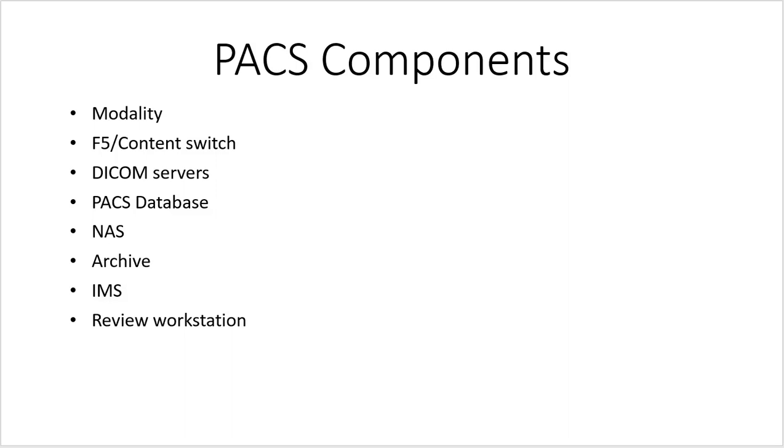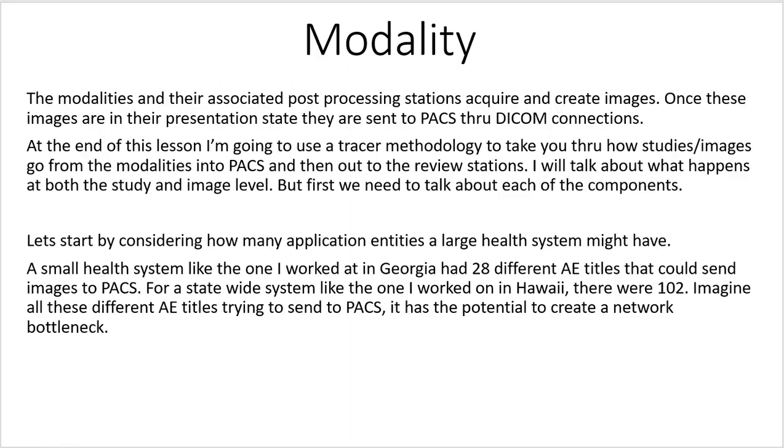Okay, today let's talk about the PACS components. The components of a PACS system are the modality, the F5 content switch, the DICOM servers, the PACS database, the NAS, the archive, the IMS, and the review station. Let's go through those individually now.